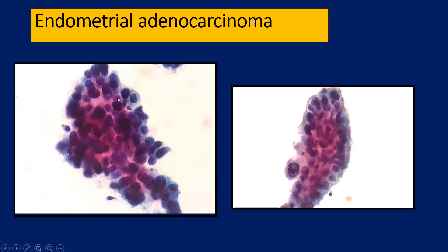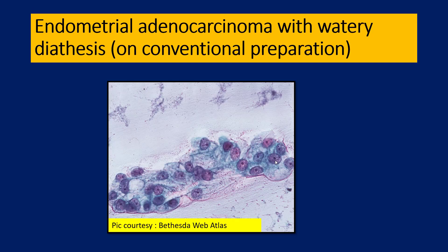Watery diathesis is not very well appreciated on liquid-based cytology preparation — it is better seen on conventional preparation. This is a picture from the Bethesda Web Atlas. The villoglandular type of endocervical adenocarcinoma is different — in villoglandular endocervical adenocarcinoma the nuclei are far more bland. This picture is from the Bethesda Web Atlas for watery diathesis.